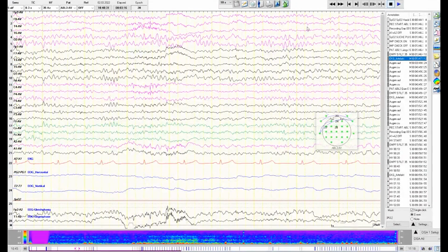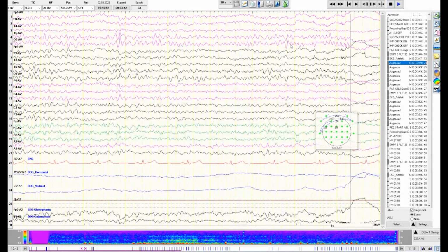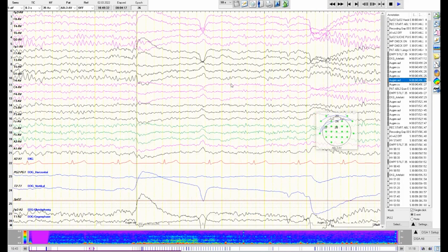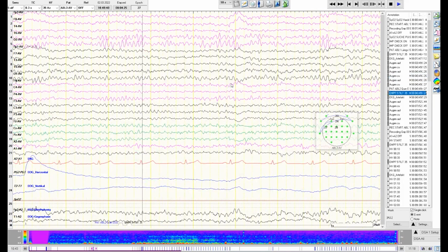And we also recognize that slowly the vigilance is going down. We see that the alpha waves that we see every now and then are going down. Here in that part, a totally desynchronized EEG, a flat EEG. So this person slowly drifts towards sleep. And as we can see, the person opens the eyes again and closes the eyes. And we see the Berger effect, so the occurrence of alpha waves is fine. So this person has a good reaction on closing the eyes and also opening the eyes. Here closed eyes, eyes open, and the alpha rhythm just vanishes. So the alpha effect is very nice. So the vigilance for that part seems okay.